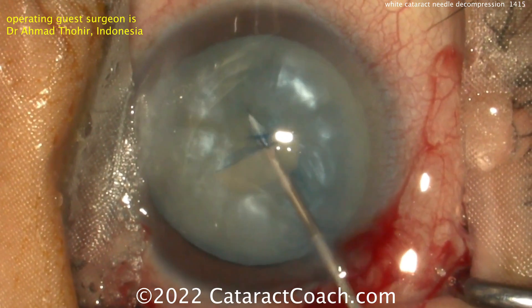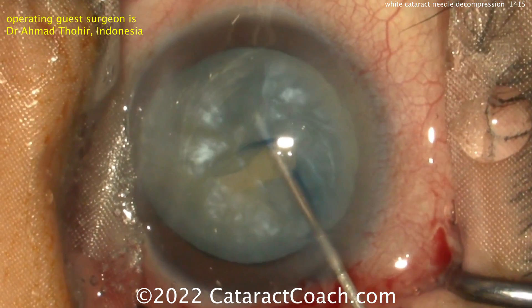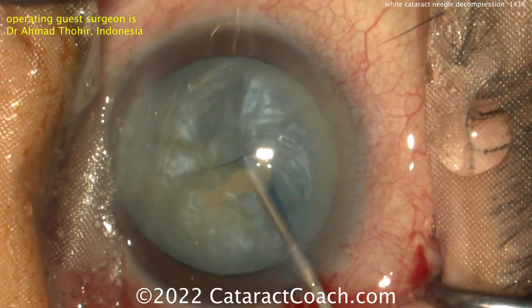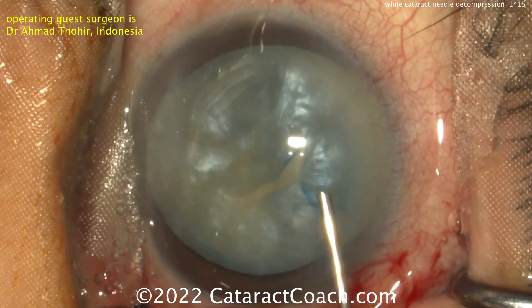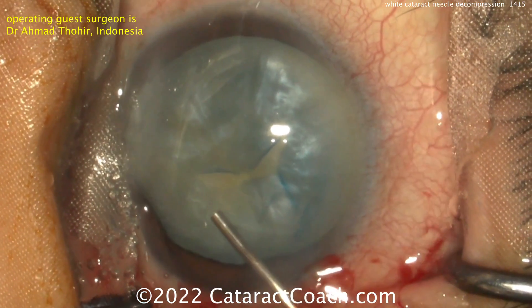But in this case, bevel up works too — it's whatever your preference is. Notice how the anterior capsule is already ripped a little bit uncontrollably. You've got to be careful here. Now refilling with viscoelastic is a smart idea.